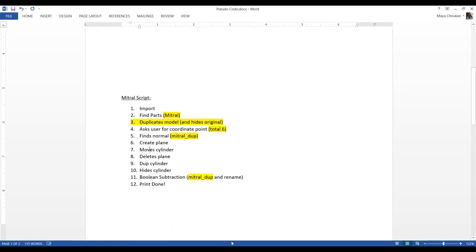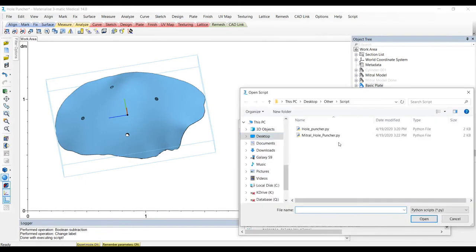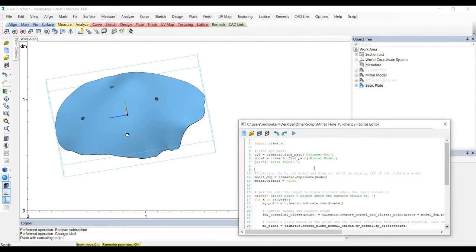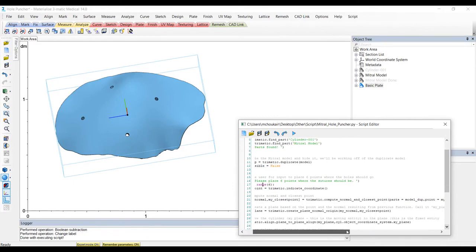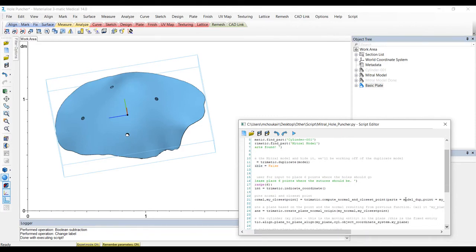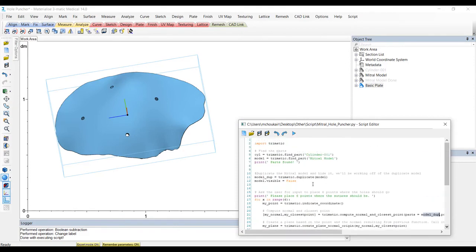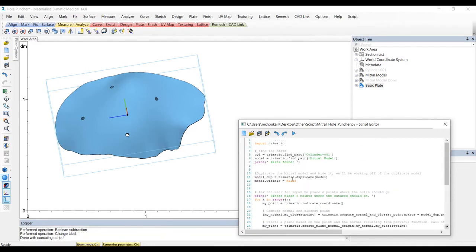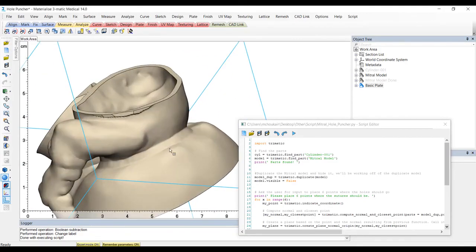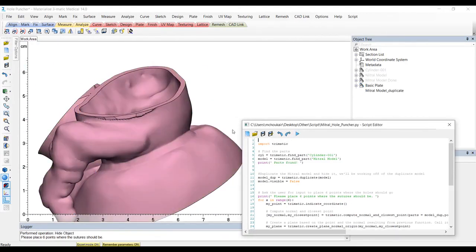For the sake of time, I'll go ahead and just pull up my modified script. But you'll see that I've changed everything that we've talked about where I've also added this duplicate step, hid the original, and then everything else later on is using the duplicate of the model. So for this duplicate step, I just copy pasted that from down here. And so really, I didn't have to type anything other than the name of my model. Let's run it and make sure it's been changed properly and does exactly what we'd like it to do.